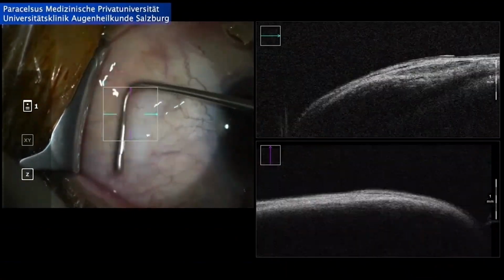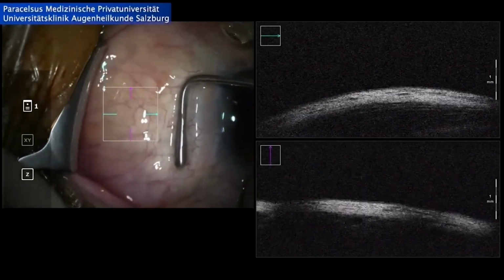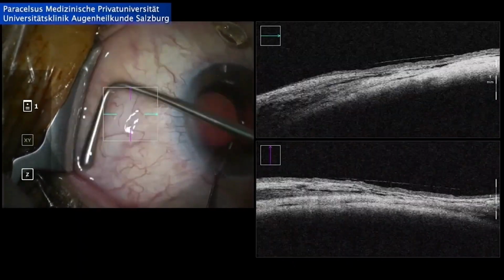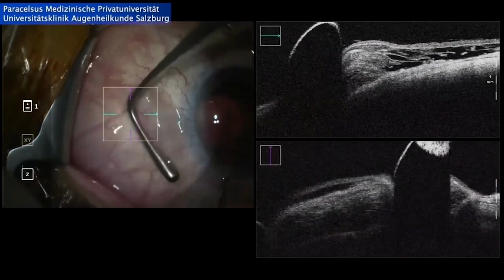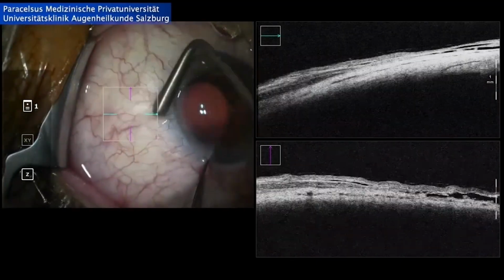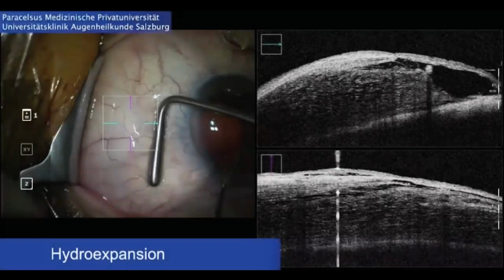When we see these images, I think it's very easy to visualize what we mean with tissue or interstitial resistance that can be present at the end of the implant, and it is very highly likely to have an implant that is entangled or trapped in these Tenon's layers when we do the implantation. This also helps us understand why the maneuvers we used to do in the past, where we tried to straighten the implant using a cannula or a hook, were not effective because we were not taking care of the root cause, which was the implant being caught in Tenon.